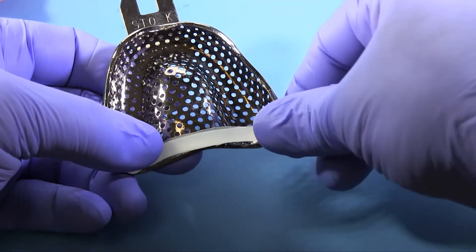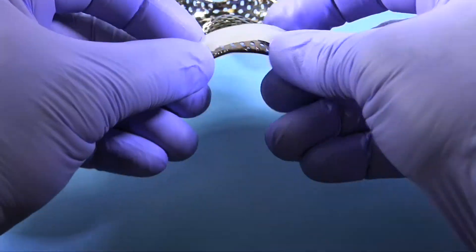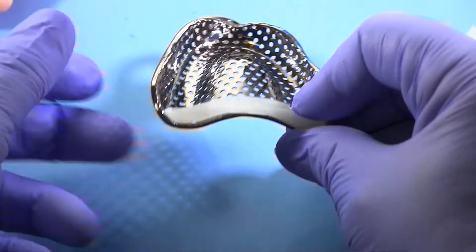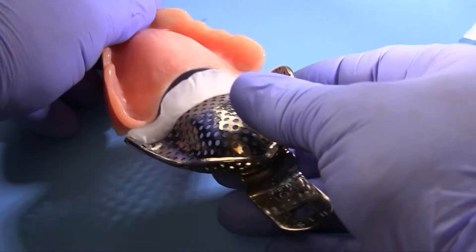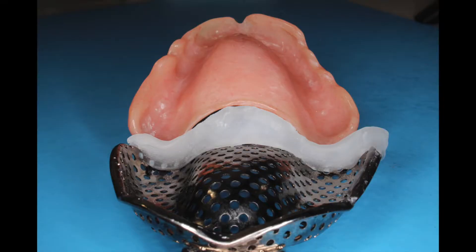Add utility wax to the back of a thoroughly dried tray. This will prevent excess alginate from falling to the back of the oral cavity during the impression. If the tray is not dry, the wax will not stick. Mold and shape the wax, thinning the superior edge so that it takes a contour similar to the posterior border of the patient's existing denture.